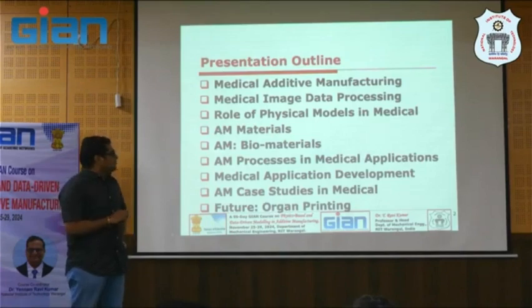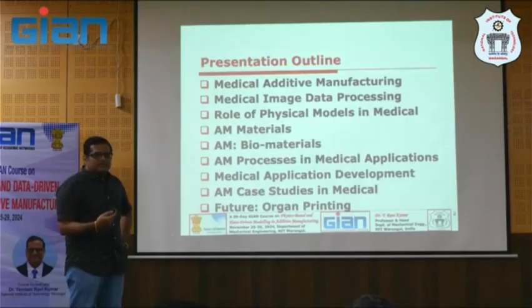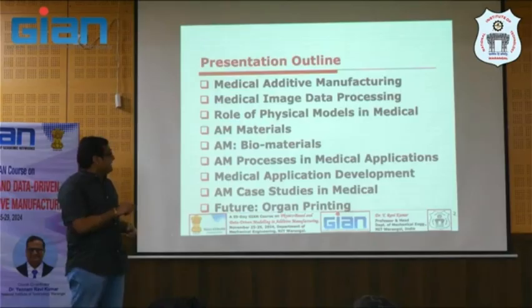So we use medical image processing for that. Once you have done the medical image processing of the images, we can save it right there as an STL file. Basically, we need an STL file to 3D print or additively manufacture your model. In this case it is a biomodel acquired from the patient data.